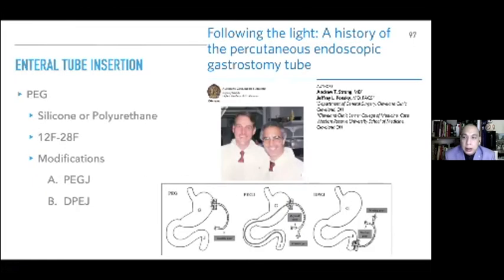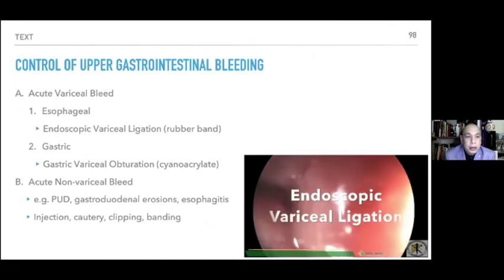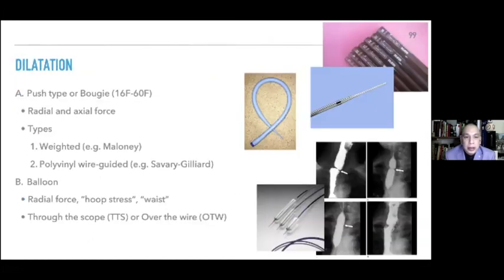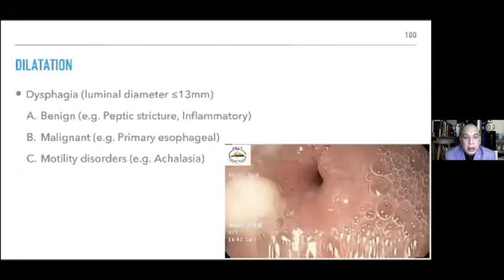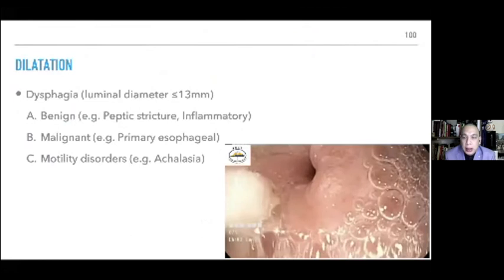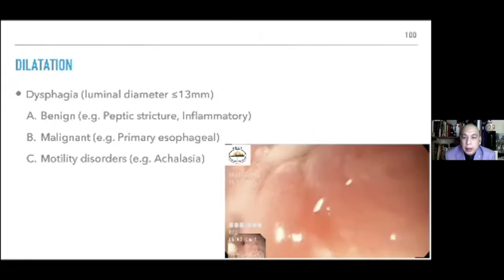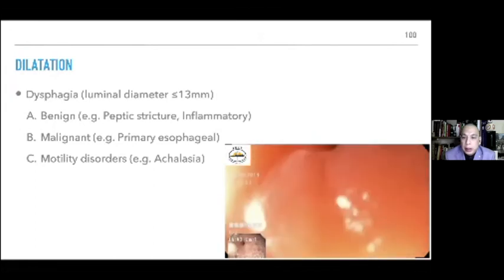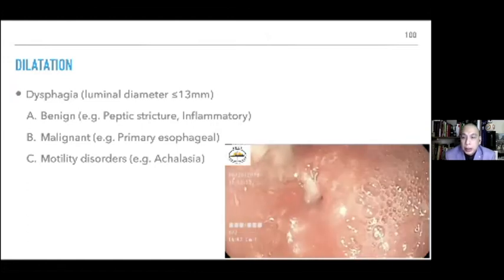And then as surgeons doing some innovations in surgical endoscopy. As mentioned earlier, control of bleeders, as shown in the videos, dilatations using bougies. And this is an achalasia patient needing dilatation. We're not able to perform POEM, but this patient will be needing this. This is not an achalasia patient, but this is an esophageal stricture post-surgical, and we're going to dilate this with a CRE balloon.